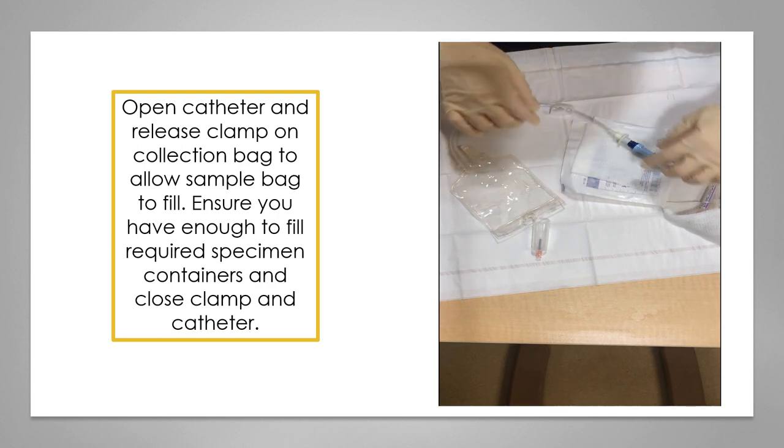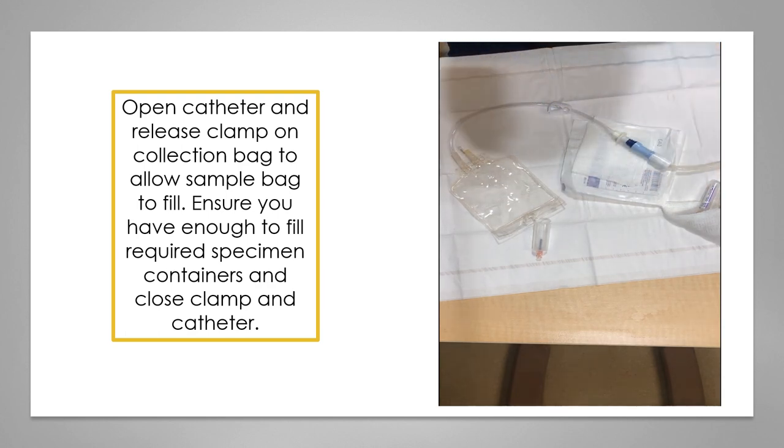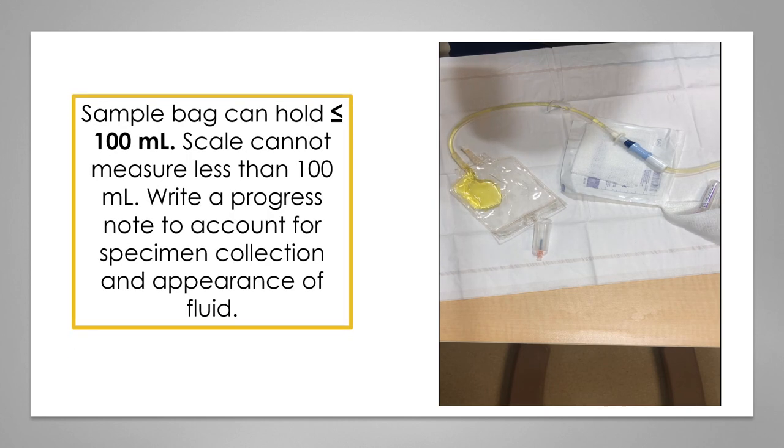Open the catheter and release the clamp on the collection bag to allow it to fill. Once you have enough to fill your specimen containers, close the clamp and catheter. The sample bag can hold no more than 100 milliliters.